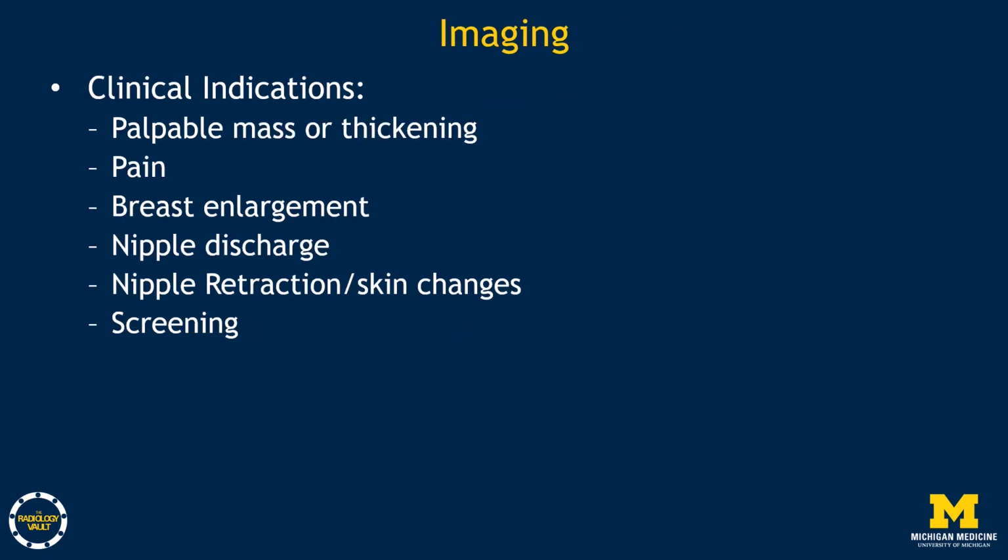Clinical indications for imaging of the male breast include a palpable mass or thickening, pain on its own or associated with other symptoms, breast enlargement, nipple discharge, nipple retraction or skin changes, and screening.